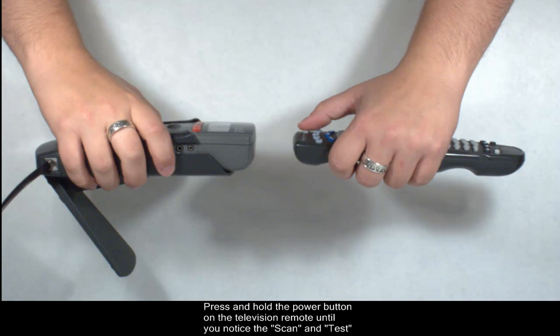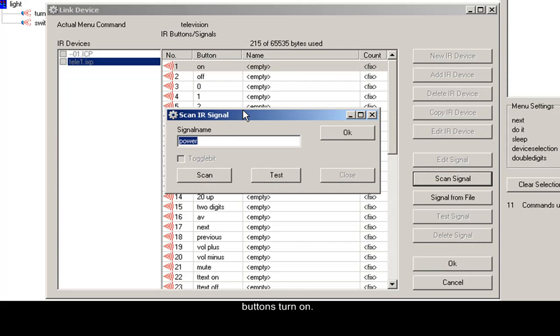Press and hold the power button on the television remote until you notice the scan and test buttons turn on. That means the signal was received. You can test the signal by clicking Test while pointing the Sicare at the television and see if it worked. If nothing happens, or if the television turns on and then immediately turns off, repeat the previous steps until you get the television to turn on and stay on.